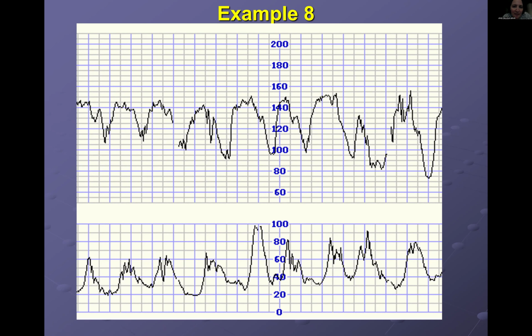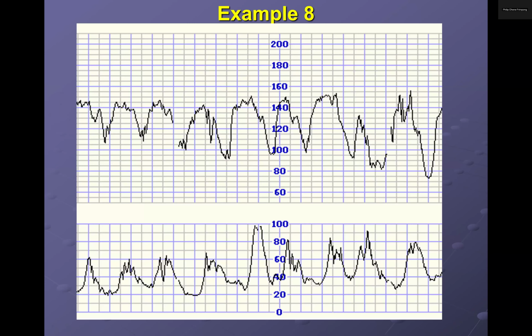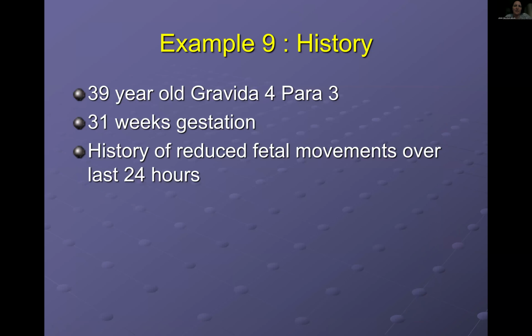Exactly. Here it was OP, okay? But with these late decelerations, you need to examine. She was 8 centimeters before she left the private hospital. So you need to examine, and again, you need to expedite delivery. I hope that by the time she was transferred, she's fully dilated, and they're going to assist and expedite the delivery. But if she's still stuck at 8 centimeters, you need to consider it.